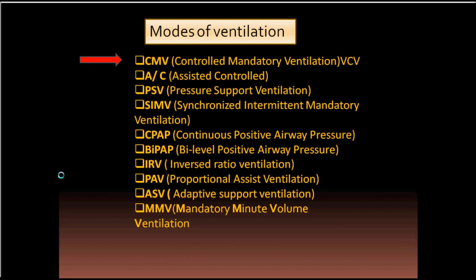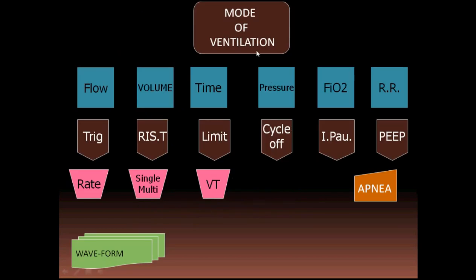We have a lot of modes of ventilation, but we'll start talking about controlled mandatory ventilation from the volume controlled type of ventilators. We have volume controlled, as I've mentioned before, pressure controlled, and the pressure controlled volume target. Now I'm going to talk about controlled mandatory ventilation from the volume controlled type.